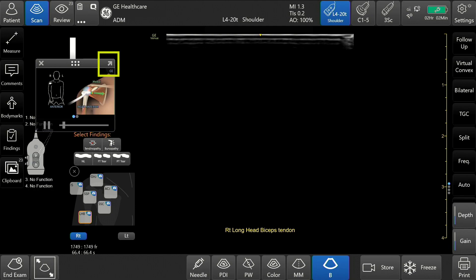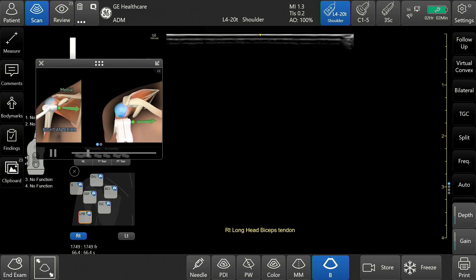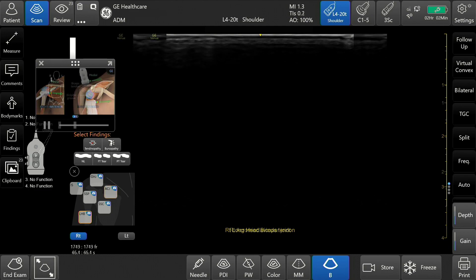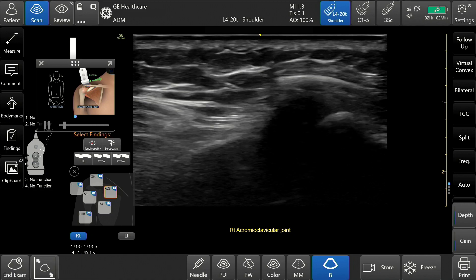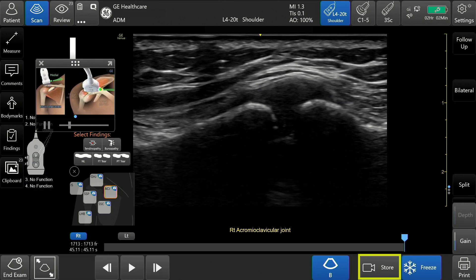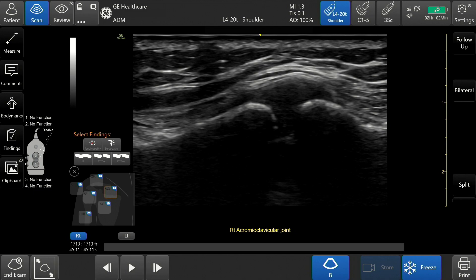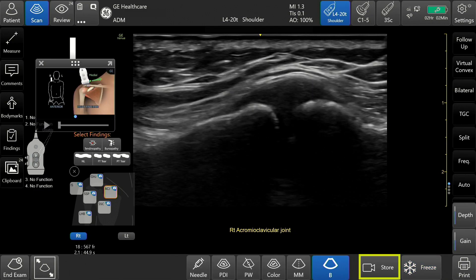Make the image display larger by tapping the enlarge button above the window. Tap again to shrink. Scan the anatomy of interest. Obtain the desired image by tapping Freeze, then Store. Or a video clip by simply tapping Store.